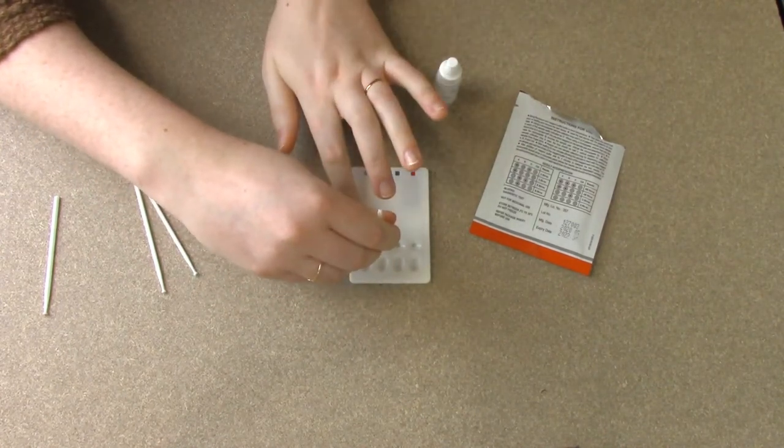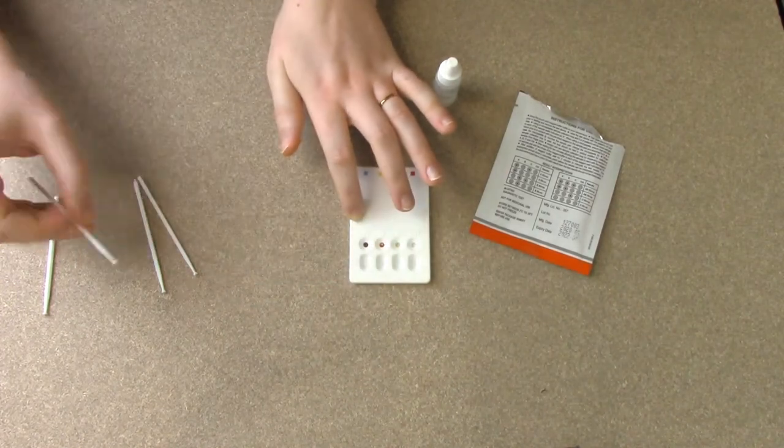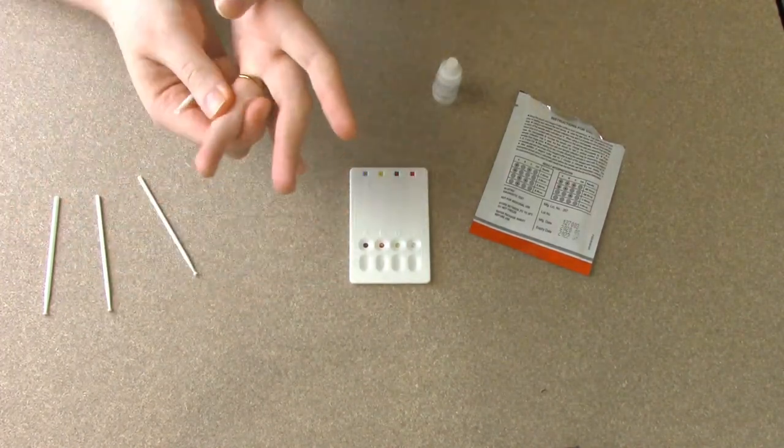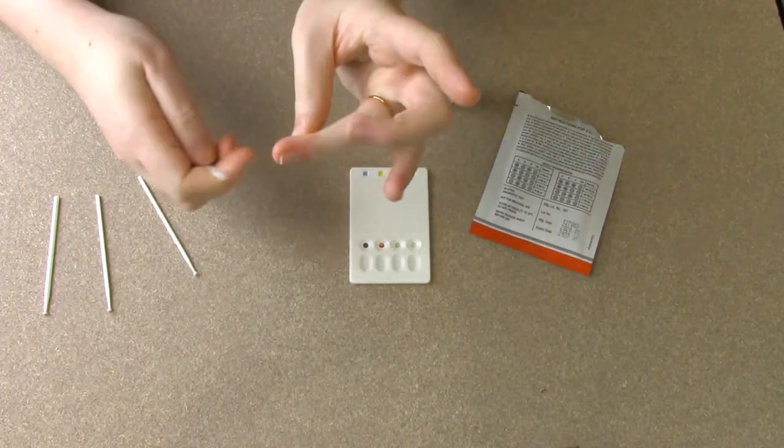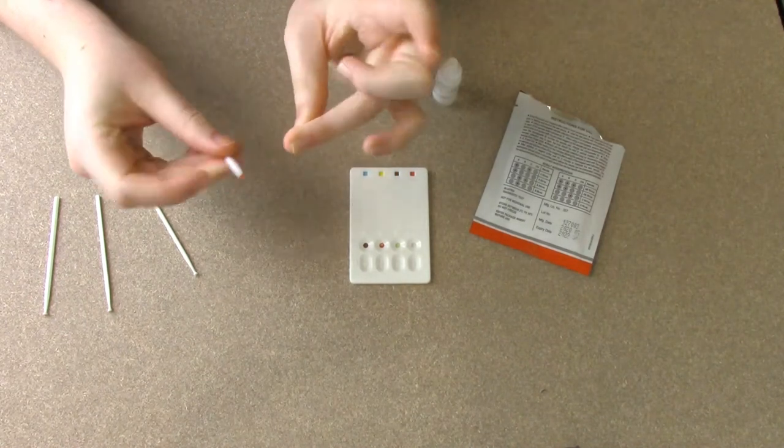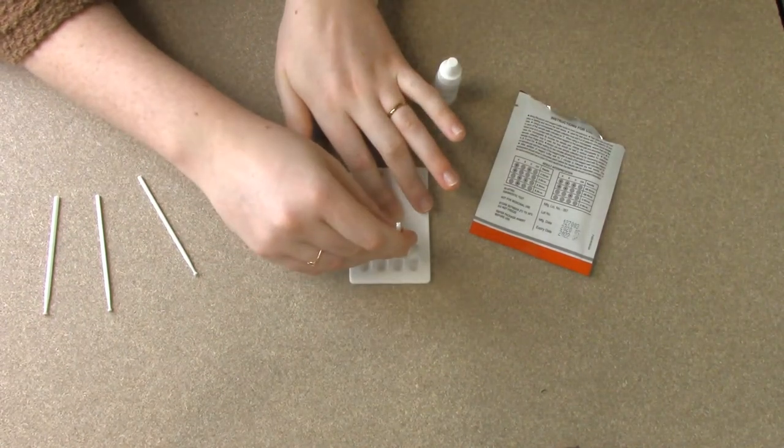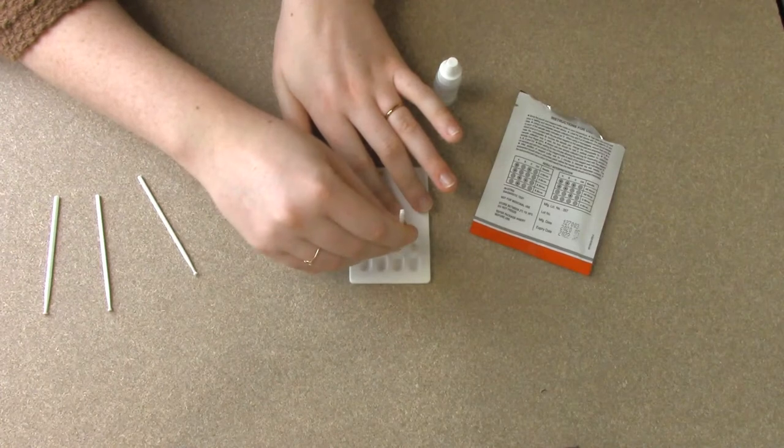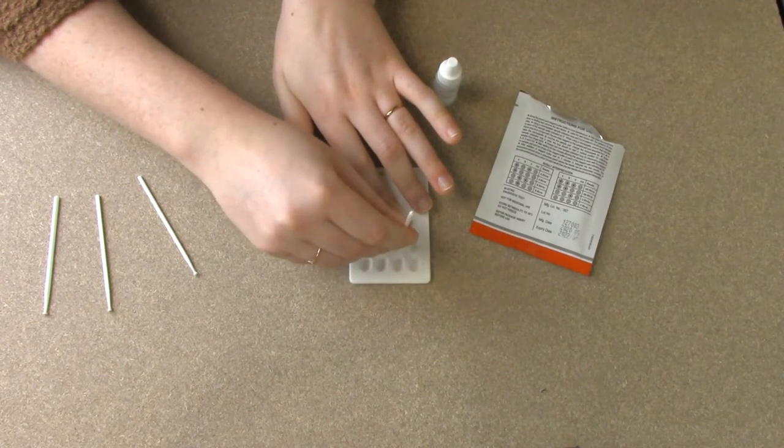And we are putting this blood into the row that's labeled S. We're not going to put any blood into the R row at the bottom. Get my third drop here. Remember to use a different stick for every single sample and drop. I have it in D now.